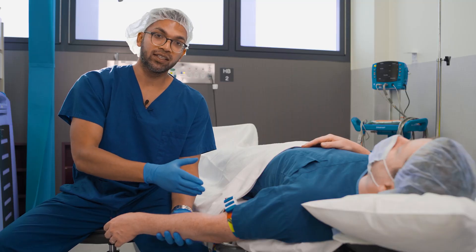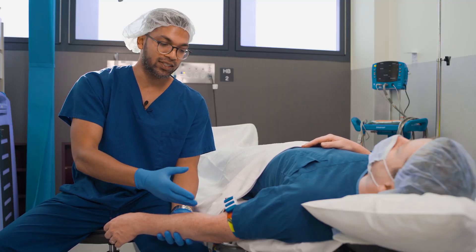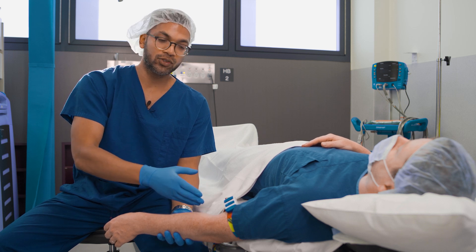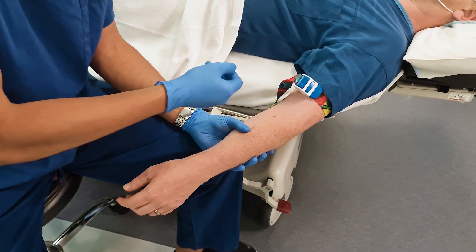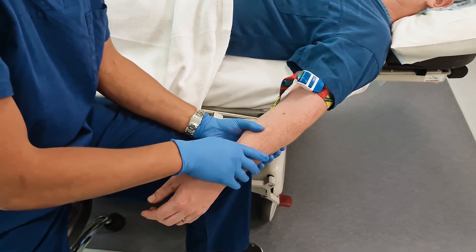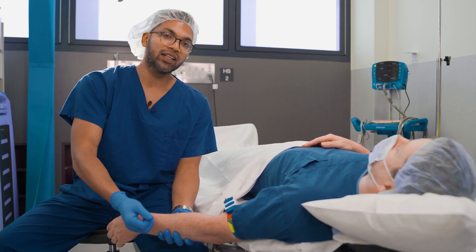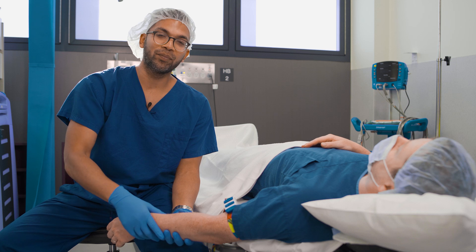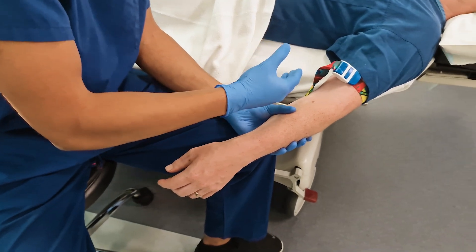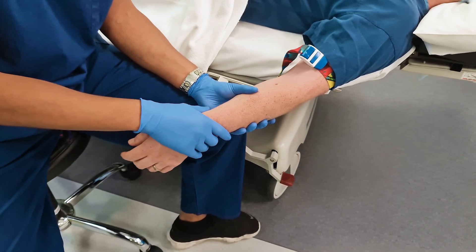Those are great reasons to try the antecubital fossa, but unfortunately there are also some challenges. There are a lot of structures there — such as nerves, arteries, and tendons — that you might accidentally impinge on, and that's something you really want to avoid. For the patient, after being in hospital for a while, they'll be really annoyed by not being able to bend their elbow. Bending the elbow with antecubital fossa veins can mean they might not get the flow of fluid or medications they need.